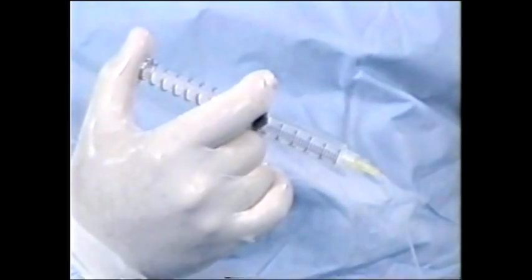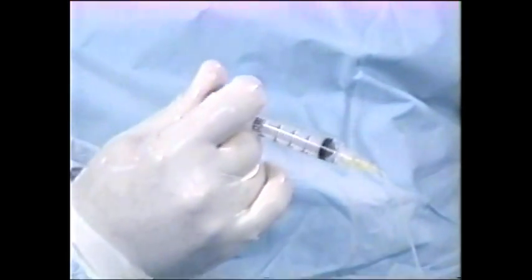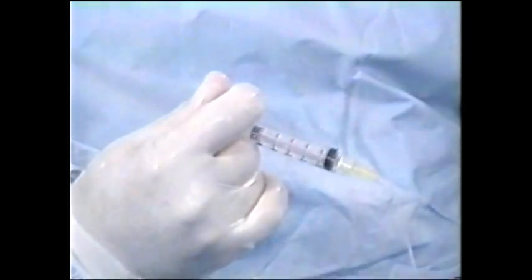Stop cutting at Descemet's membrane or at the first sight of aqueous. Release suction by depressing the plunger or cutting the tubing. Complete the penetrating keratoplasty in your usual manner.